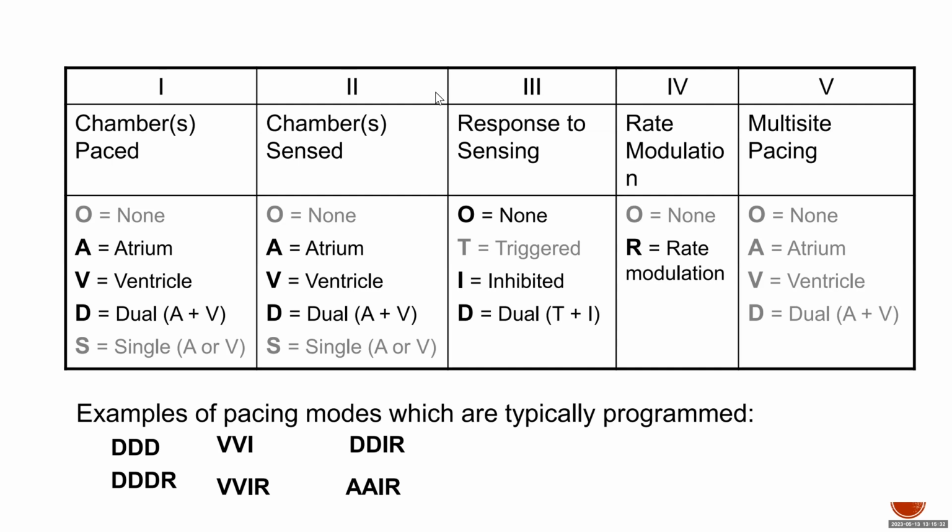Trigger means that I want to coordinate between the atrium and ventricle. So I want the atrial pace to trigger ventricular pace after a certain period that I determine, so that the device isn't pacing atrium or ventricle without coordination. I want, when the atrium is paced, the device to wait and then pace the ventricle.